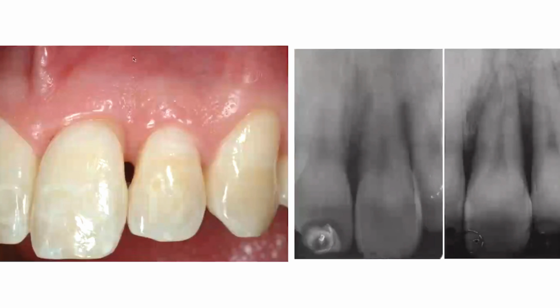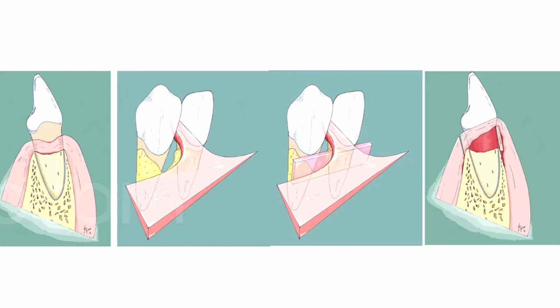Here, there is a very, very thin, small, but intact soft tissue isthmus. That means that I can preserve this by making what? The palatal incision, remember?